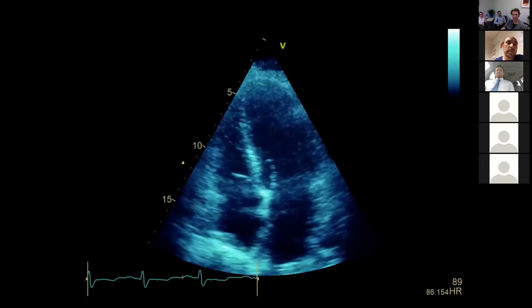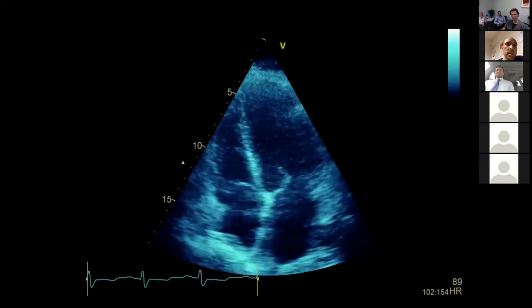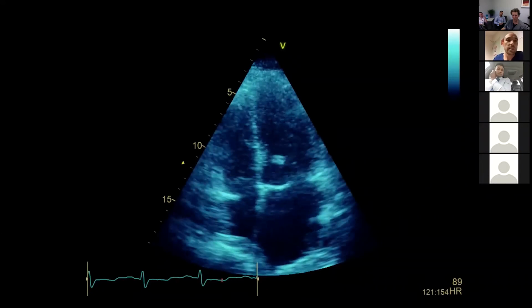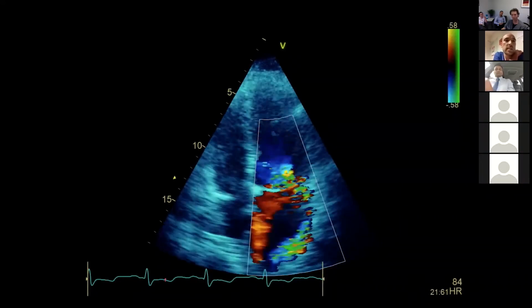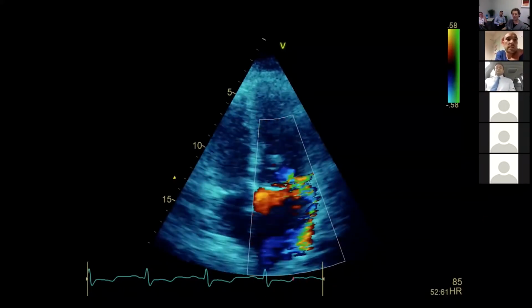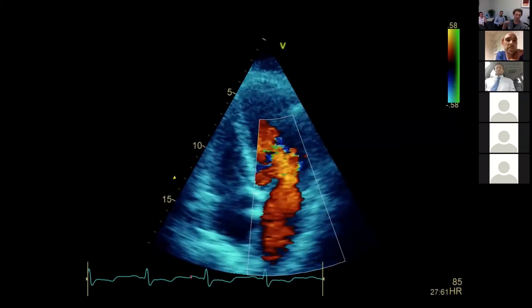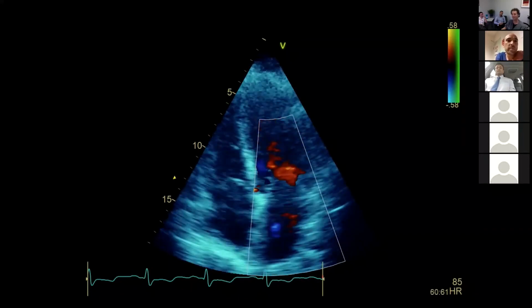And so just like you were saying, you can see it now, the massive papillary muscle is just sort of wibbling around there in the left ventricle with the akinetic lateral wall, giving you that massive, beautiful Coanda effect with its huge vena contracta and PISA and chaotic blood flow, and that eccentric MR, just like you said, is severe.